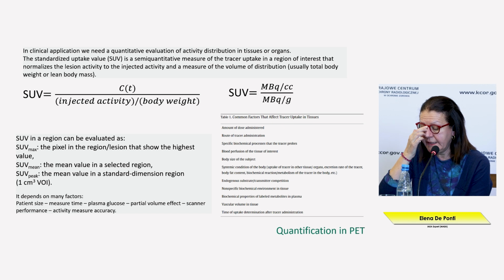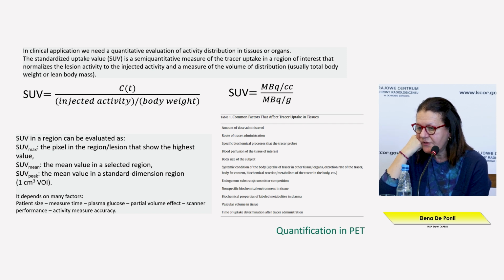Moving to the metrics that are used in PET-CT, I have started in my recorded presentation with the definition and some details on SUV. You have already heard something from John, so I'm not taking too much time to speak of SUV.